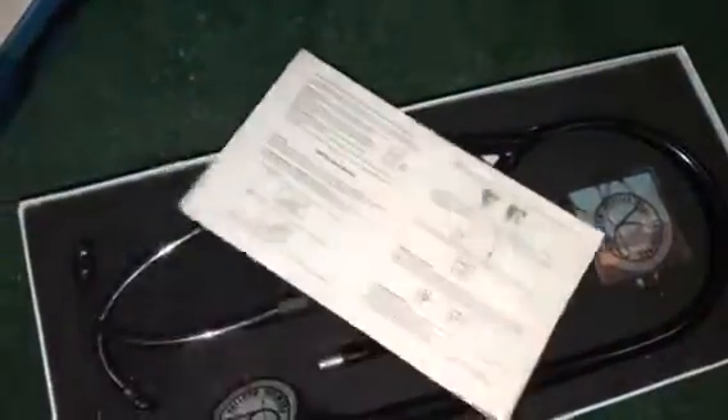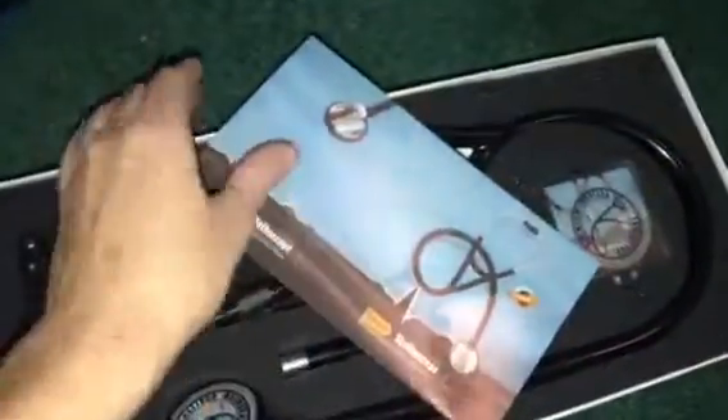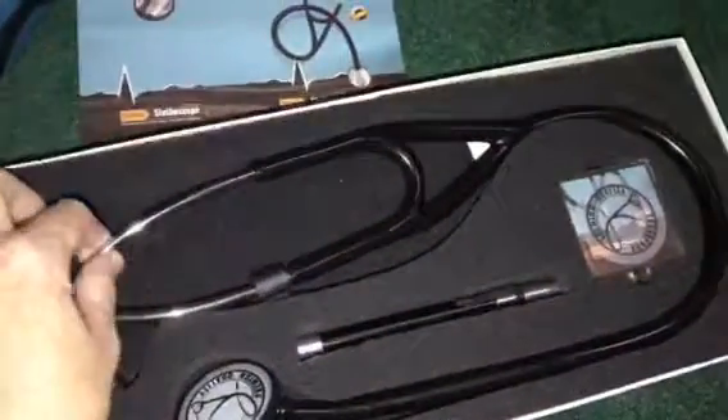When you open the box, this is what you will see — there is a paper for the stethoscope that tells you the directions, and it shows you a picture on the front.